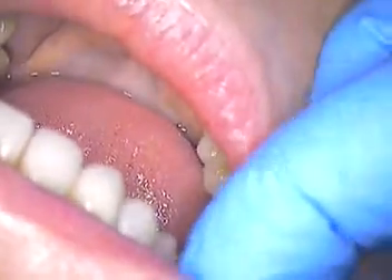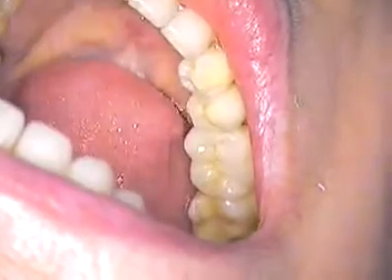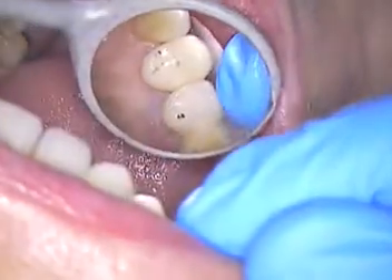Cotton roll is in. I'm going to check our occlusion — we have the paper ready. Here we go. Closed down together and tap, tap, tap. Grind your teeth side to side. Open, please. Looks like we're right on target. Does that feel good to you, Victoria? Yes, it does. Alright.